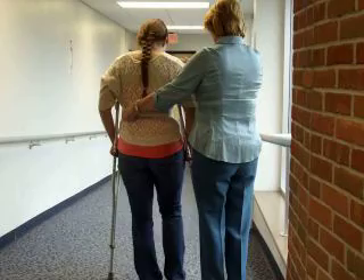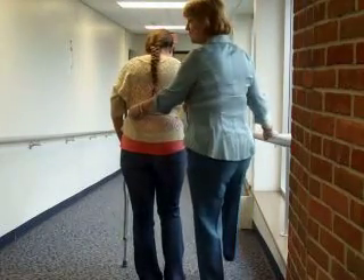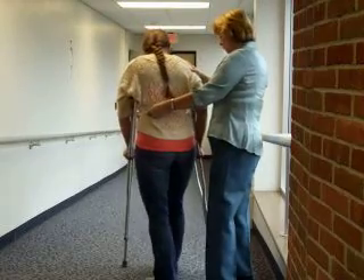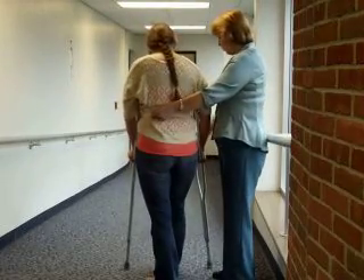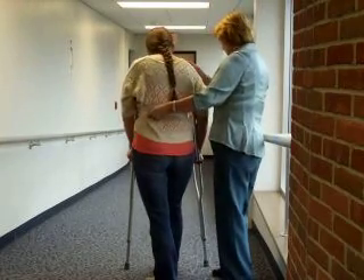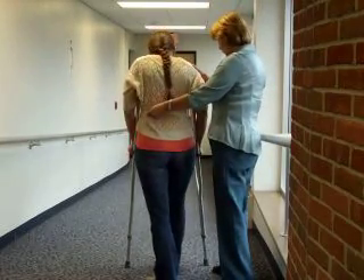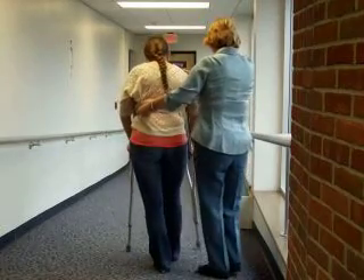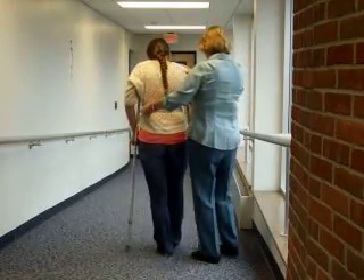So now we're going to have the crutches go down first. Her foot stays ahead of her. Your angle is going to be so that your strong side is angled down. The crutches are angled and her body is angled. So then the crutches go down, and then just step your strong leg between those crutches. The right foot is staying off the ground. A little more angle.